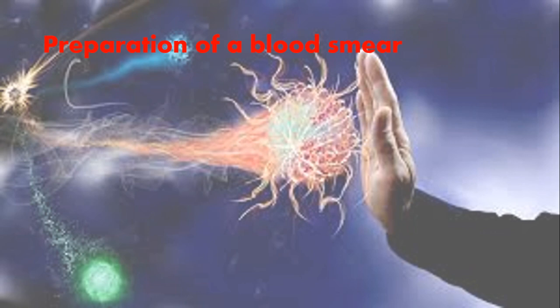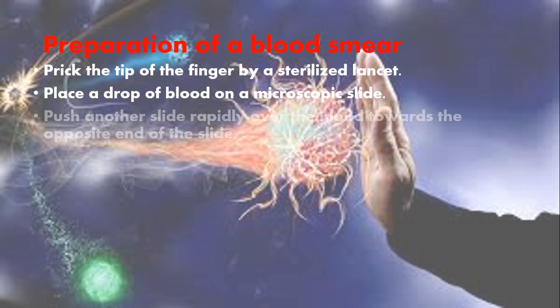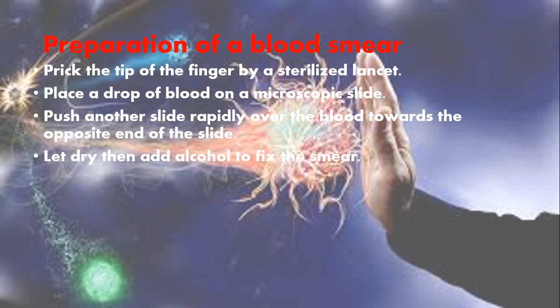First of all, we're supposed to know how we can prepare a blood smear. First of all, of course, you're supposed to sterilize the finger you're going to prick. Then after pricking the tip of the finger, you have to place the drop of blood on a microscope slide, and using another slide you push the drop of blood rapidly over the first slide in order to form a very thin film of blood on that slide.